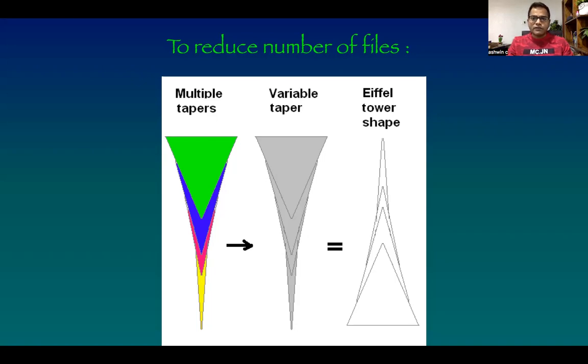But the disadvantage of the file, or the caution you have to take, what is the limitation of the file? It breaks more. Why? You try to push the file, it will break, because it has the flexible part dangling down, but the upper part is absolutely fixed in the canal. The moment you try to push, this grip will not be loosened, but the file will be broken. So that's why you have to be cautious while using progressively taper file.